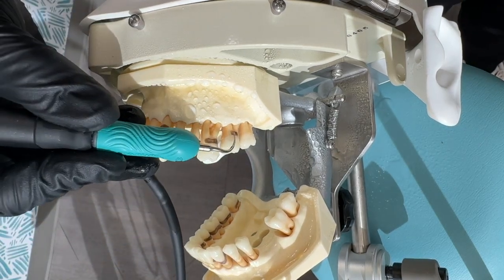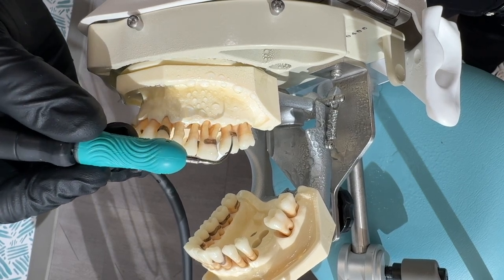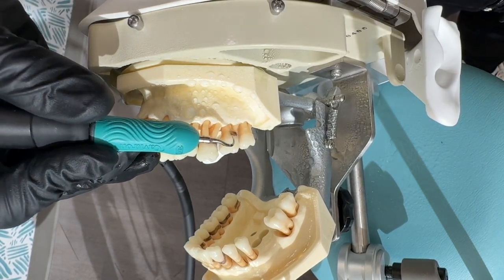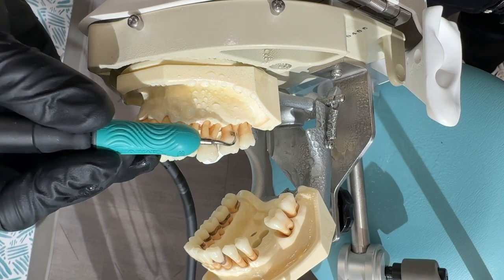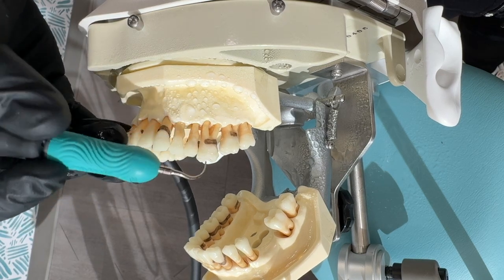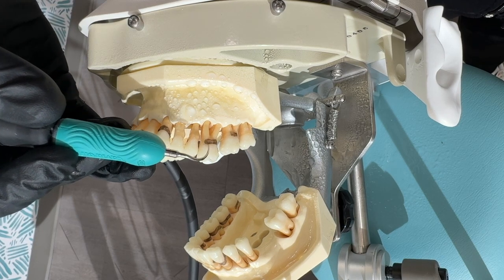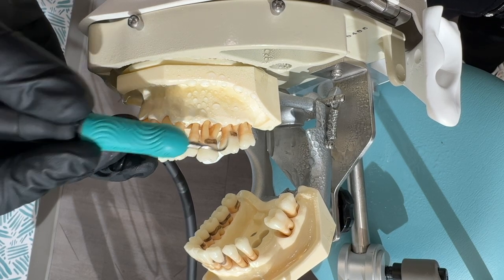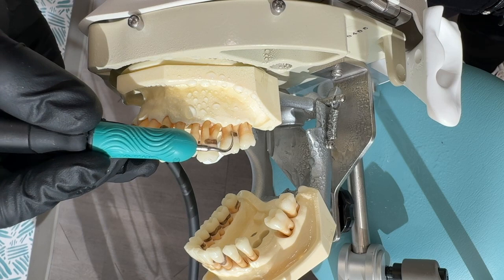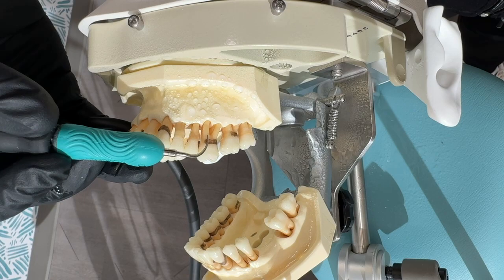It's really easy to want to push harder on it and hope that helps, but that is counterintuitive because then the tip can't move as much, so it's not going to remove as well. Instead of trying to push through, I would grab a triple bend — a power line 1000 or something with a triangle or diamond cross shape — to get this bulk off first, and then go back with something with a round cross section, a little bit thinner, to get deeper into the pocket. So if you feel like it's not budging and your power's up, it might be good to switch your insert.